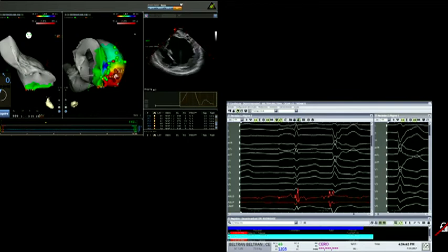¿Sabes que hubiera sido súper interesante, Diego, ver la diferencia del primer mapa totalmente perdido con solo eliminar el notch? ¿Tú lo viste? The notch. Pero sí, no tienes cómo volver a marcarlo ya. Do a remap and take only the notches, the notching.